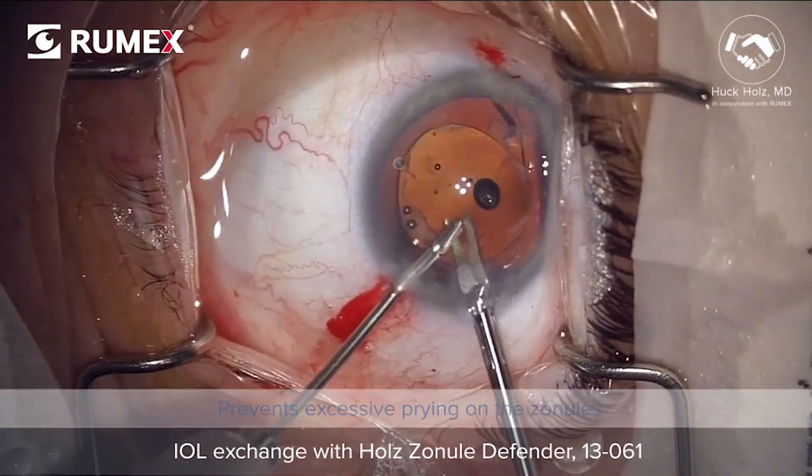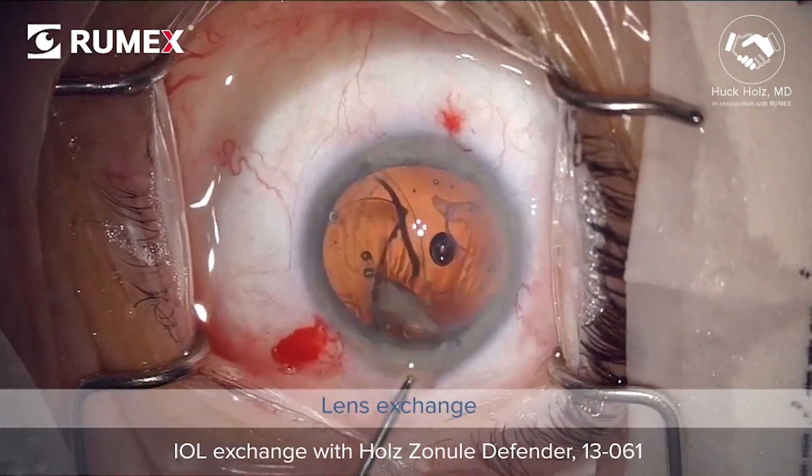The lens is then hemisected and removed, and finally the new lens is injected into the capsule bag.